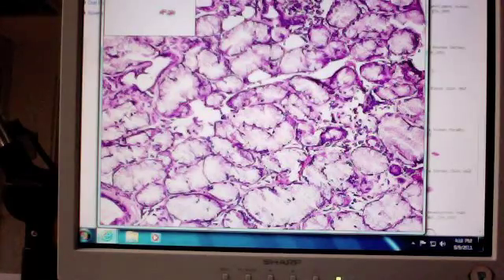What would you call it? A bunch of cells, ha ha. All right, this is a compound multicellular gland. All right, compound because it's not a little discrete structure. It's not nice straight lines. There's lots of it.